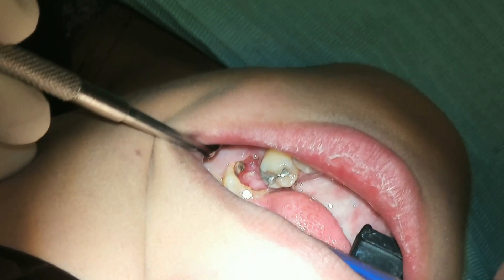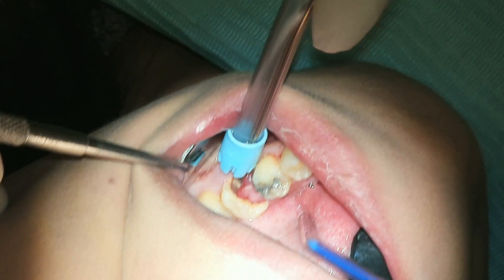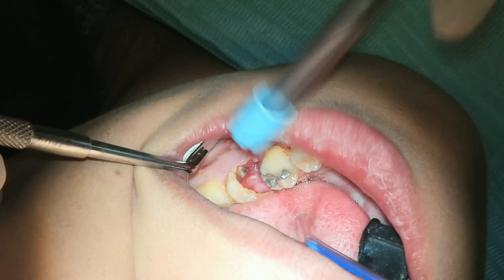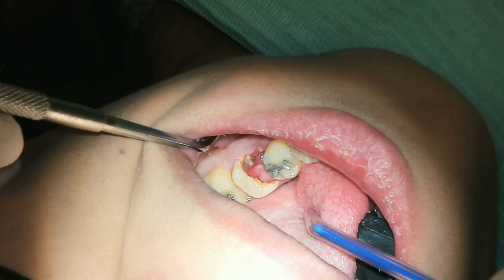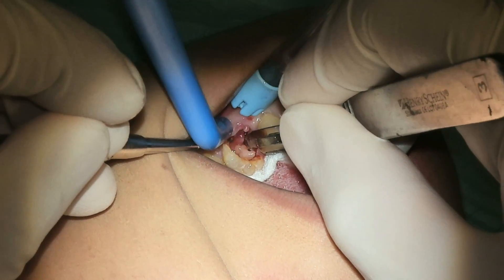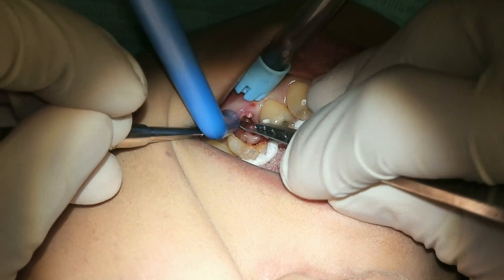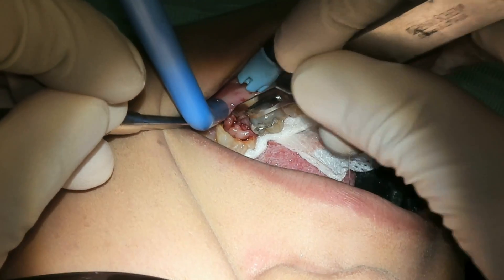Here you can see a gingival overgrowth on the mesial aspect of number 19. For me personally, if I cannot see what I'm doing, I need to make sure that I can see what I'm doing. So I go ahead and remove that diseased gingival overgrowth with a scalpel. And after I remove it, I see that the cavity drives very deep.